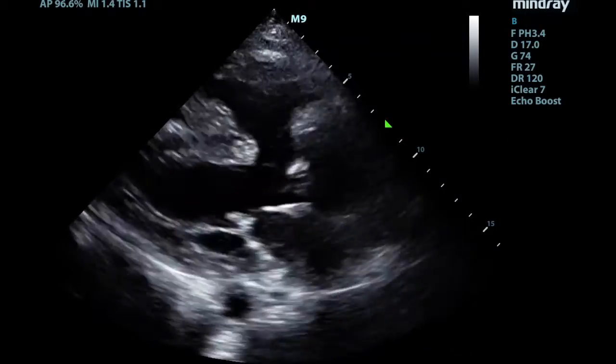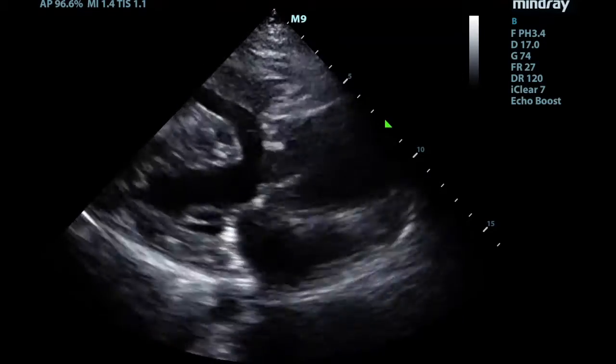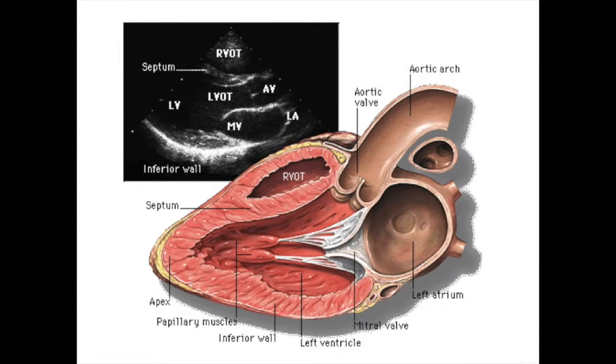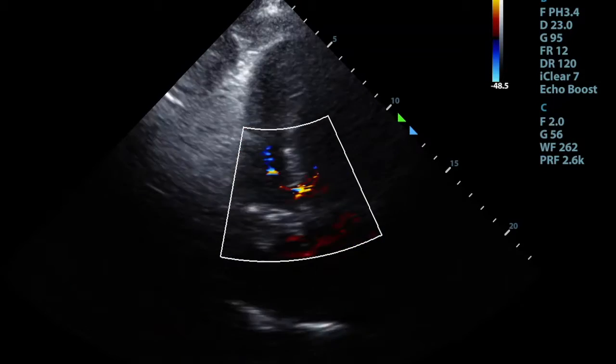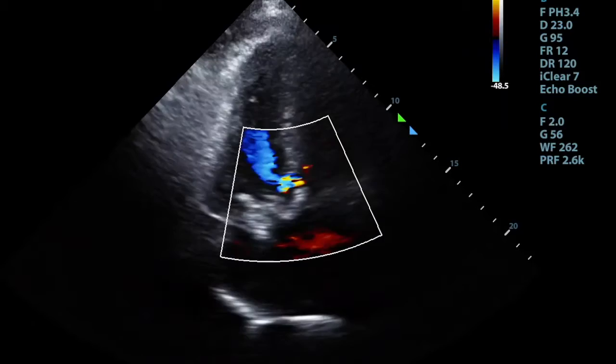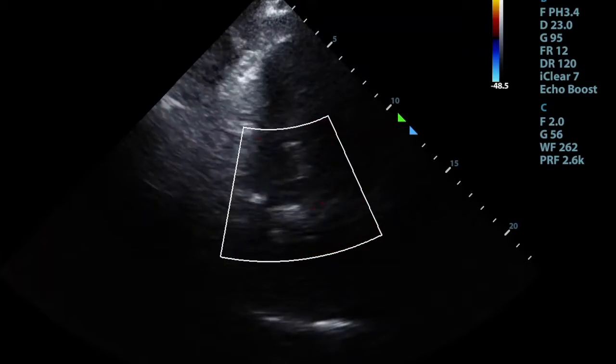Here it is on the other patient, with an even more clearly visible ventricular septal defect that is under an overriding aortic root. Here's what it should actually look like, with the aorta coming entirely under the septum in the left ventricular outflow tract. Tetralogy of Fallot is one of the classic cyanotic heart lesions in babies. Patients have some degree of mixing at the level of the VSD, which you can see here in the apical views, causing decreased oxygen saturations.